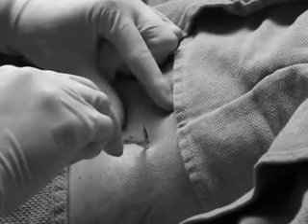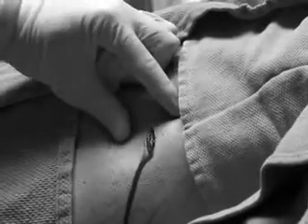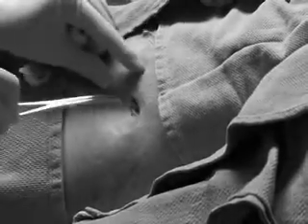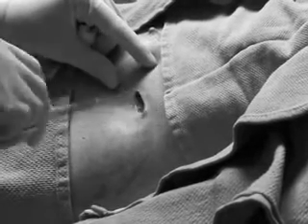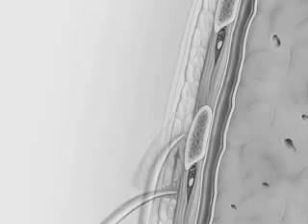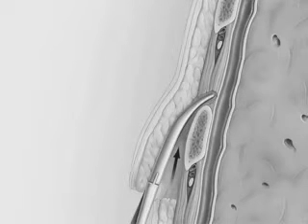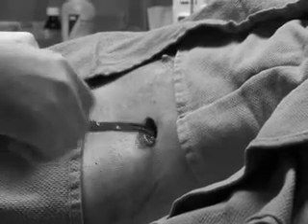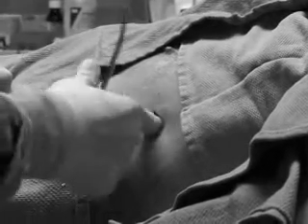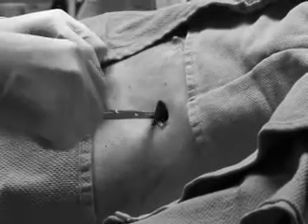Make an incision approximately 1.5 to 2 cm in length above and parallel to the anesthetized rib. Introduce the curved dissecting instrument, such as a Kelly clamp, into the incision. Begin dissecting the subcutaneous tissues in order to reach the intercostal muscles. After dissecting through the subcutaneous tissues, stay on top of the rib to guide the blunt dissection. This will create a diagonal path towards the correct intercostal space. When using a larger chest tube of sizes 24 French or greater, use your index finger to explore the tract being created by blunt dissection. This is done to ensure the larger caliber tube will be able to pass through the tract.